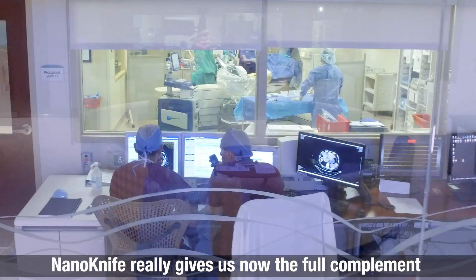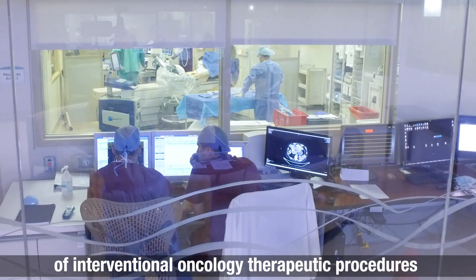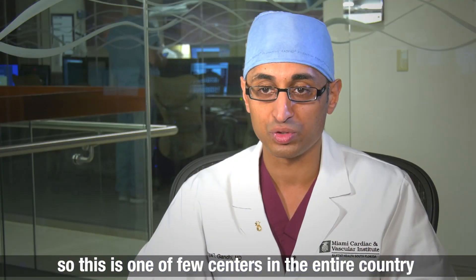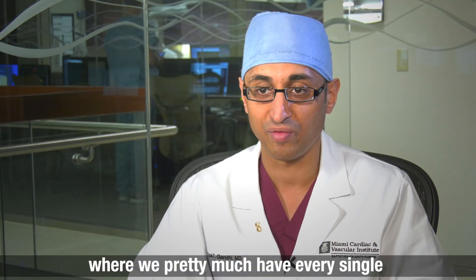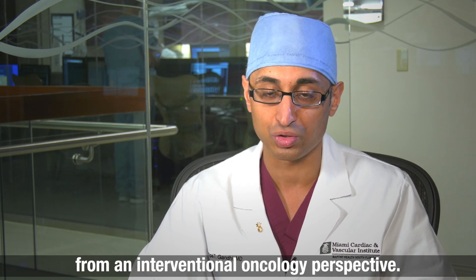NanoKnife really gives us the full complement of interventional oncology therapeutic procedures. This is one of few centers in the entire country where we have every single modality available to treat patients with cancer from an interventional oncology perspective.